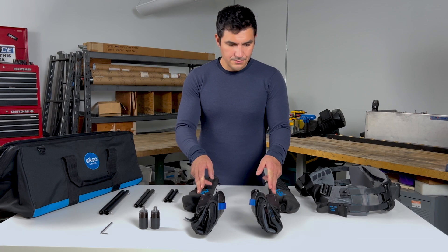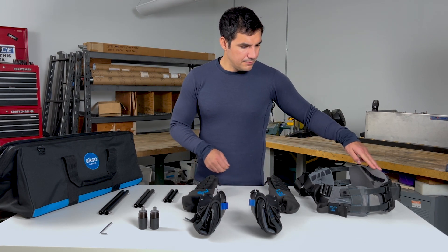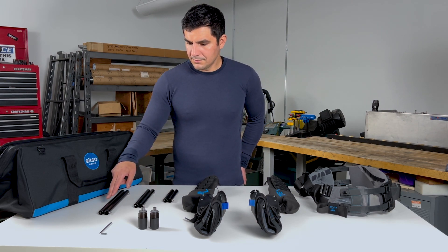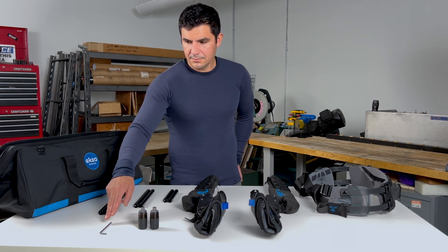In the bag you will have a left and right arm assembly, hip belt, actuator springs, small, medium and large torso tubes, and a clocking adjustment torx wrench.